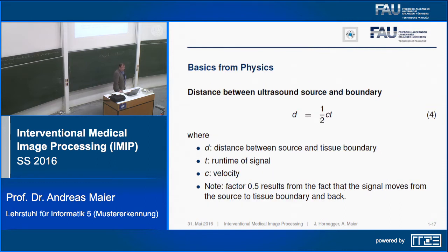Then you can also determine the distance between the source and the boundary, and this is, of course, the speed of sound times the time that has passed until the signal was recovered, and then you divide by two because the signal has to go into the tissue and come back. This is how you can actually reconstruct the depth. This is the distance.